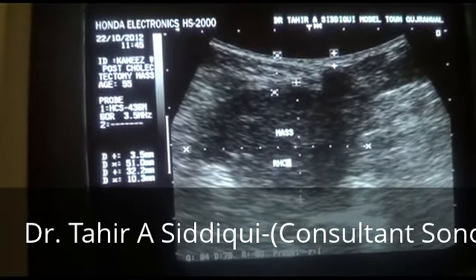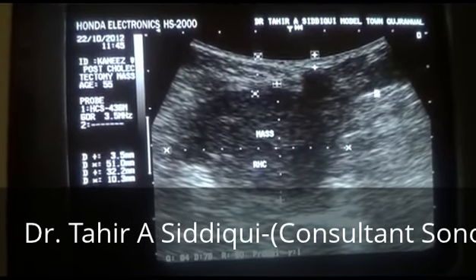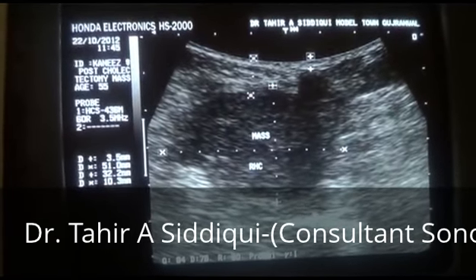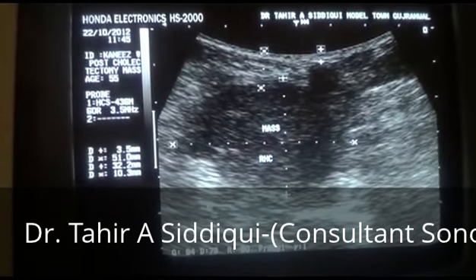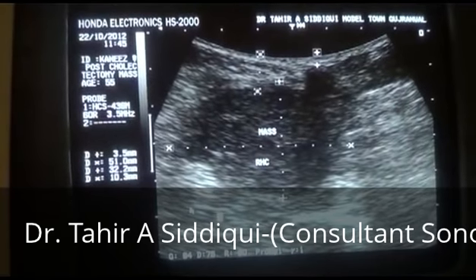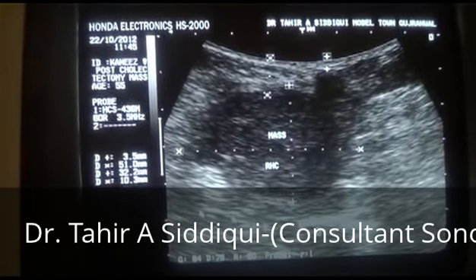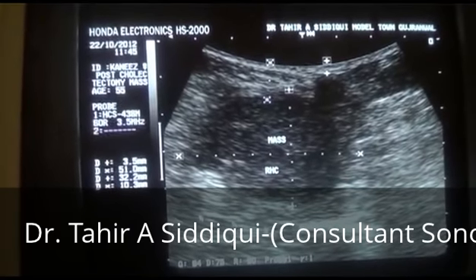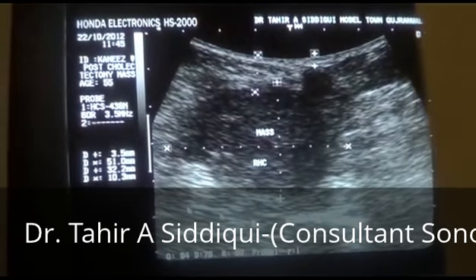These are the extensions of the mass below the skin in the subcutaneous tissue, and this is the peritoneal line. This white line indicates the peritoneal line. This is in the subcutaneous tissue below the skin.